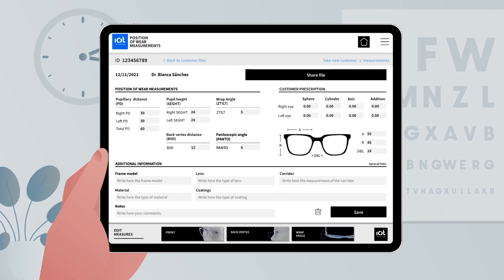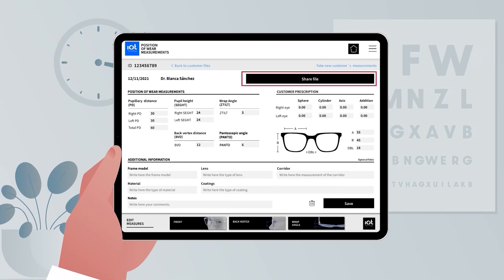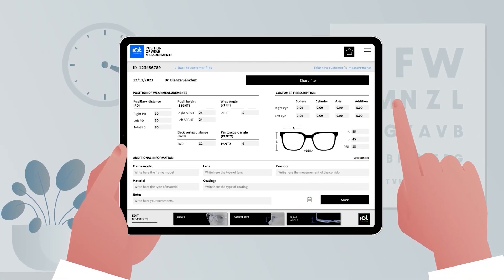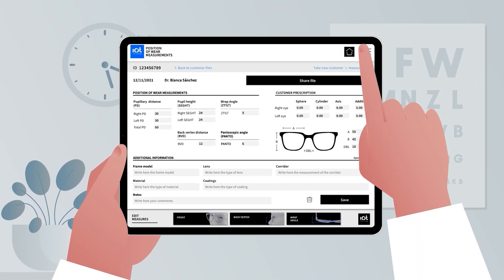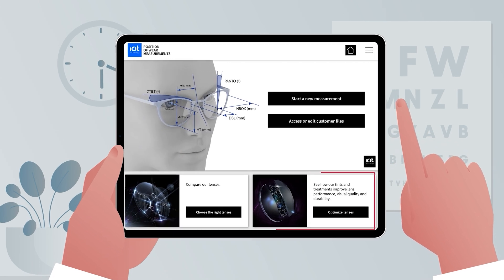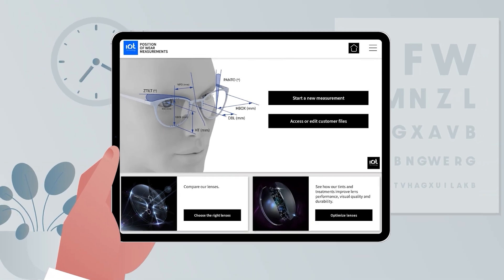Now you have a complete patient file. You can review the measurements, add notes, and share the file easily. If needed, you can edit the measurements manually by tapping any of the buttons at the bottom of the patient file screen. And finally, remember you can use these buttons on the home screen to show patients the different types of lenses and treatments available to them.